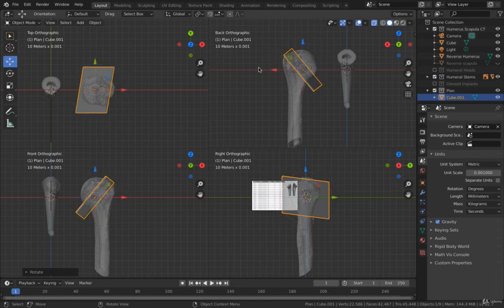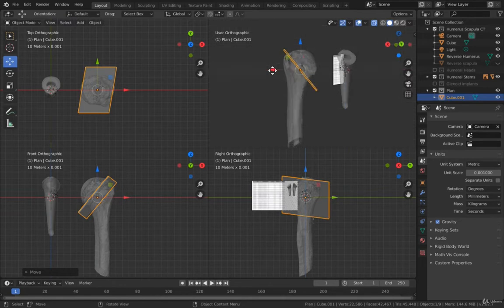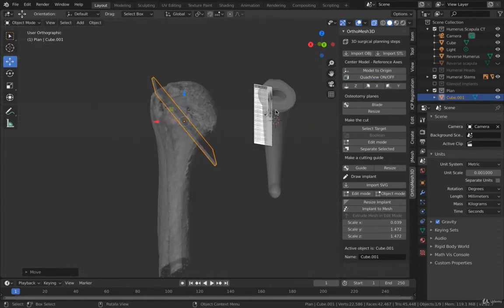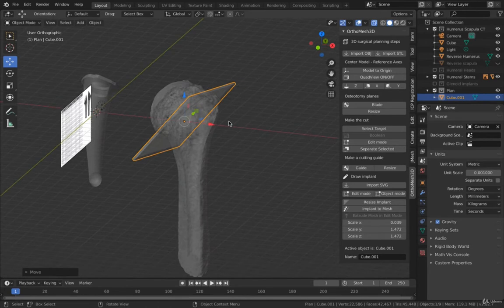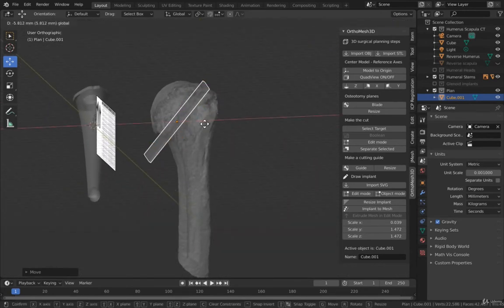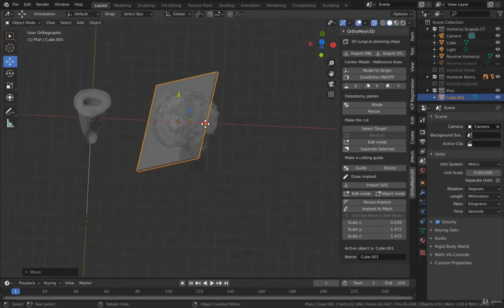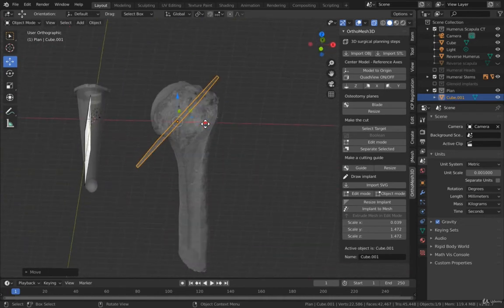Plane of resection. It may be a little bit too vertical, but it actually may be good. So we can go ahead and press the N key again and get out of the quad view, and now we can see that this humeral cut is a little bit on the aggressive side, so I'm going to move it this way a little bit. So now we can see where it intersects the humerus and how we're going to cut it.